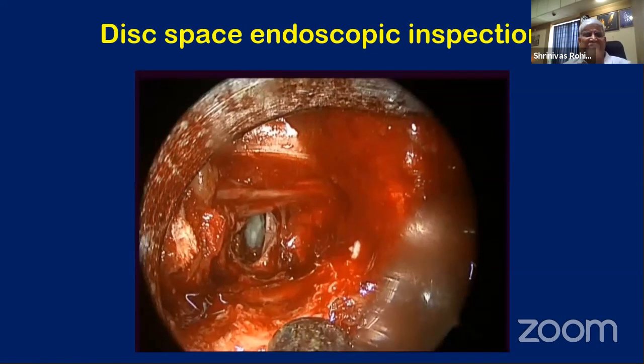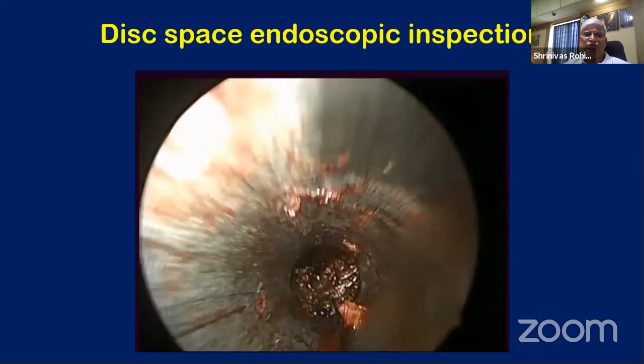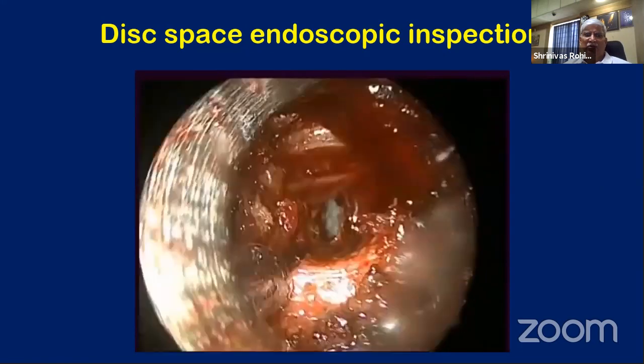Then we go inside the disc space and see whether we have missed any loose piece inside or not.